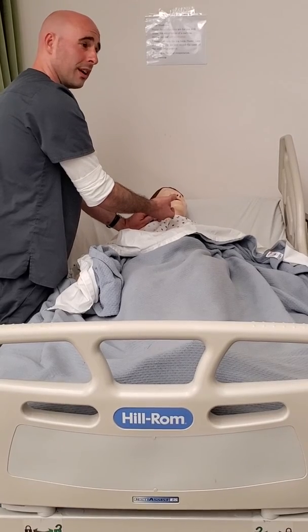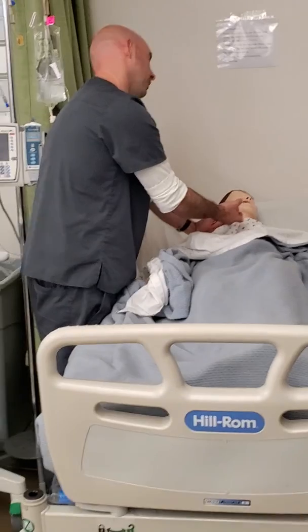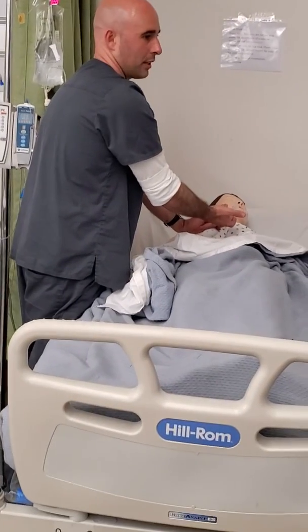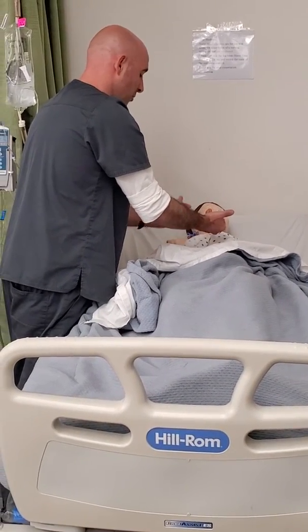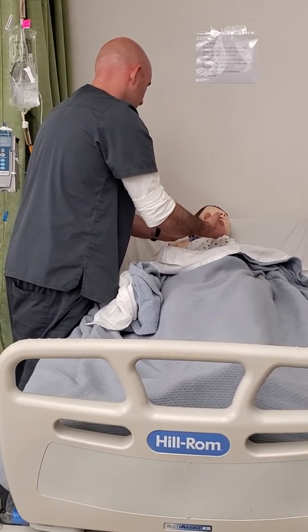It's turbulence in the line, not the atrium, right? Yeah, because it's cleaning it out, kind of like a rotary disk. So that's the rationale. Okay, so that's what I'm gonna do, and then there is no resistance, so I'm gonna insert the fluid.